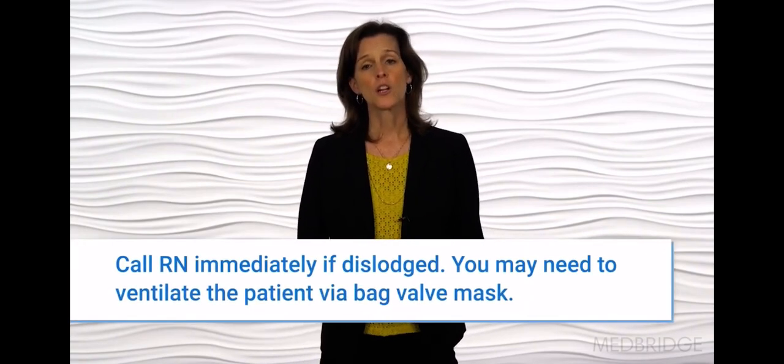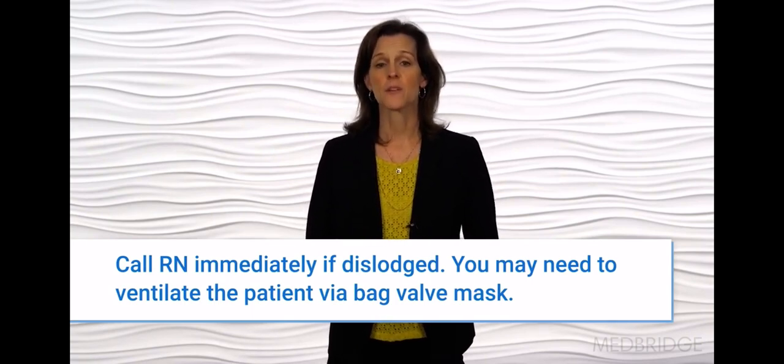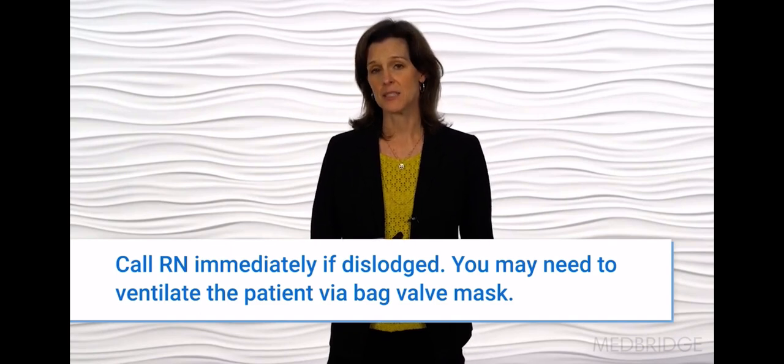There are different types of breathing tubes. One is the endotracheal tube, or ETT. This is for short-term mechanical ventilation through the nose or the mouth. You do want to note the level of the breathing tube, typically by measuring it prior to mobility, just so you can recheck it after mobility to make sure it hasn't moved at all. You want to call the nurse immediately if this is dislodged. You may need to ventilate the patient with a bag valve mask in the meantime.